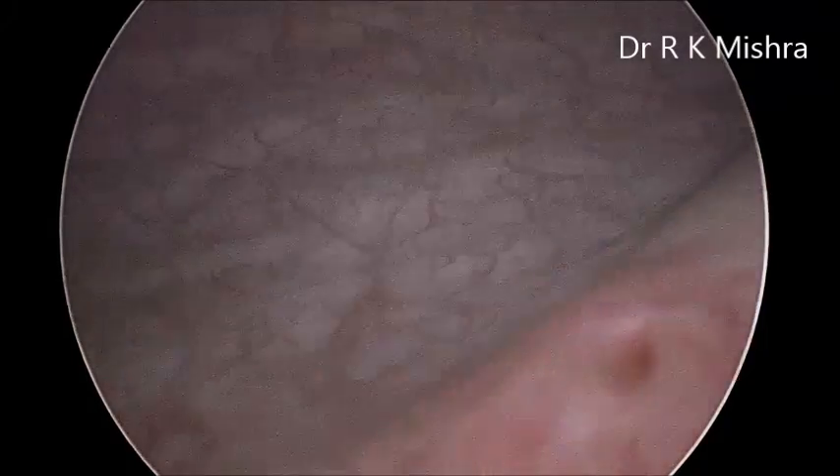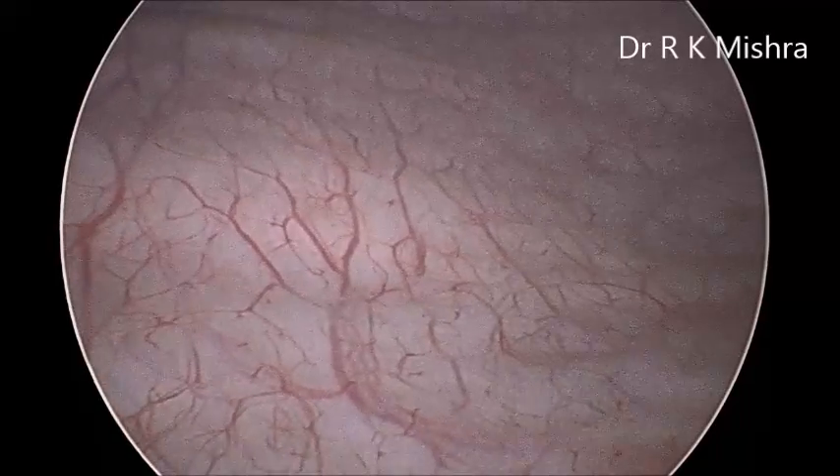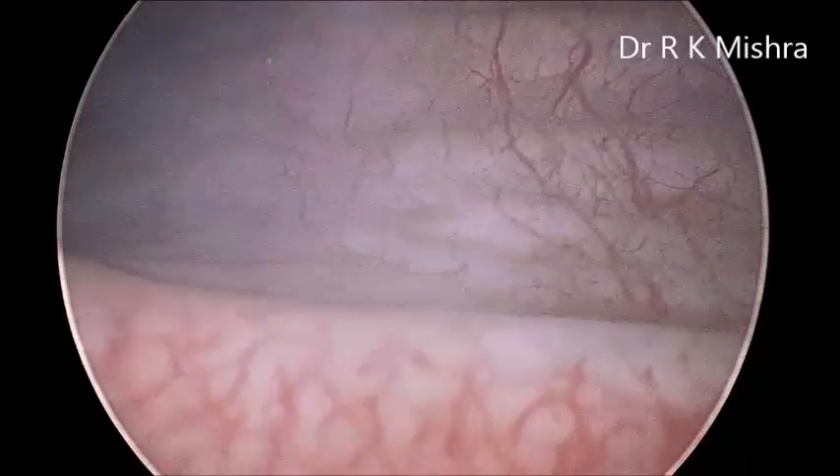Cystoscopy is important to diagnose many of the bladder pathologies, and it can also be used for putting a DJ stent, URS, or various other procedures.